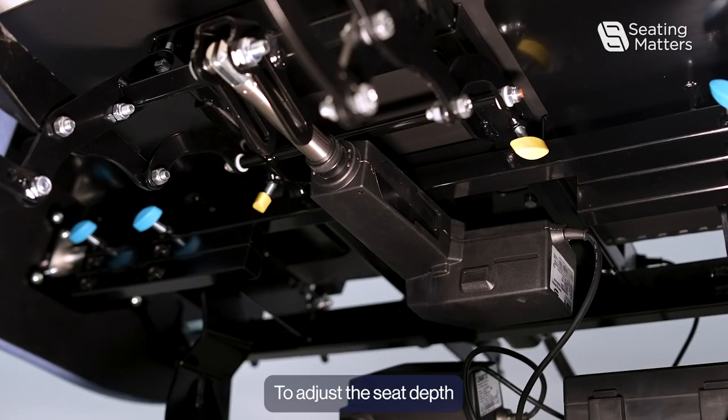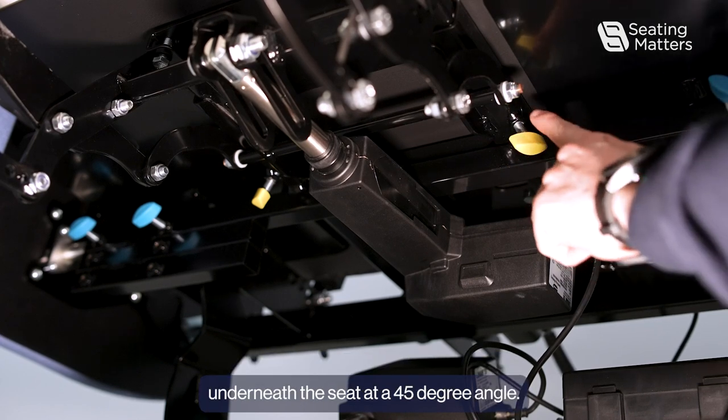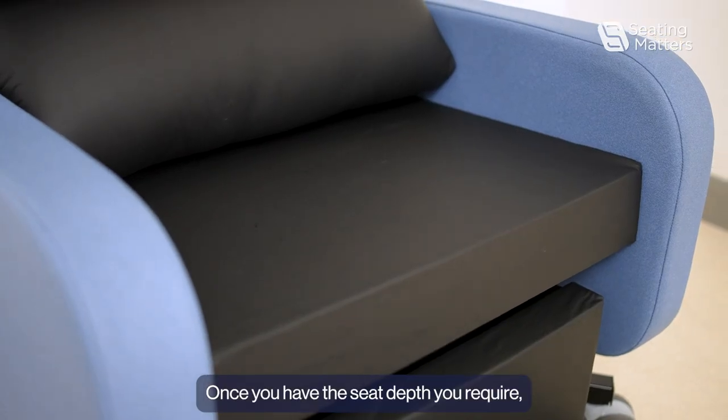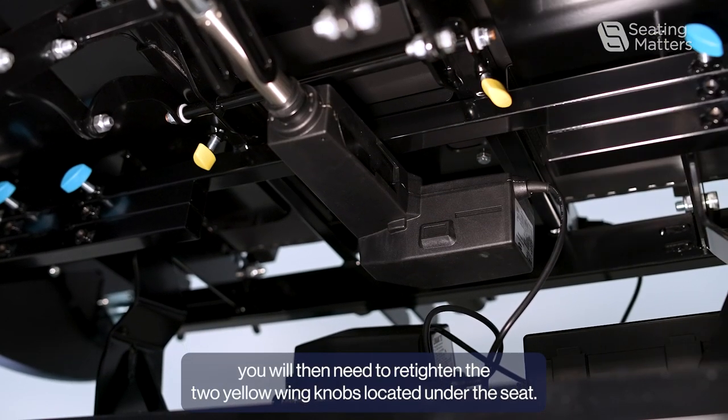To adjust the seat depth, first loosen the two yellow wing knobs located underneath the seat at a 45 degree angle. Once you have the seat depth you require, re-tighten the two yellow wing knobs located onto the seat.